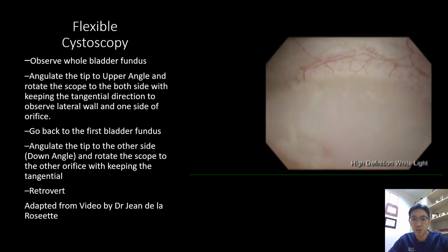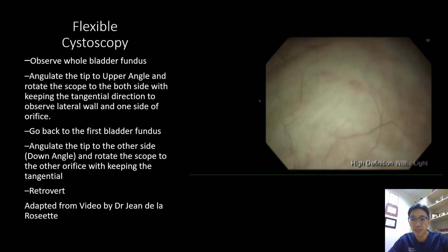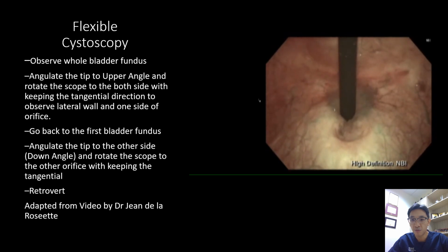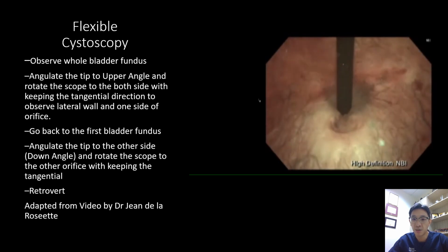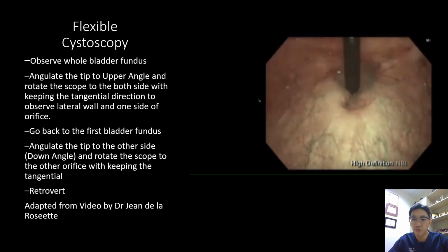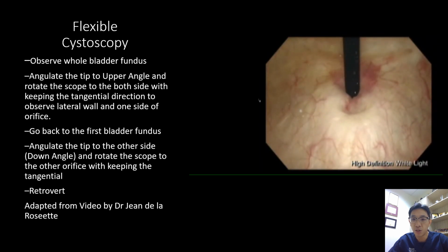It's a great idea to show these videos because from still pictures you can characterize it very clearly, but in real life the movement of the scopes is not static, and it is important to train in the visualization on a continuous movement.